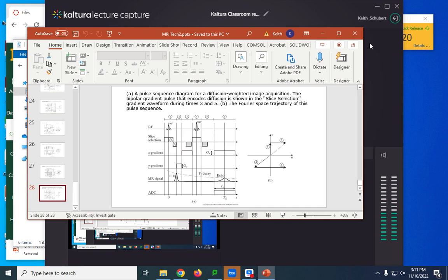And we can monitor your chest motion. Both your heartbeat and your breathing are readable on your chest. Your heartbeat makes about a 0.5 millimeter difference in your chest motion. It's really small, but those cameras can read down to about 1/10 of a millimeter, so it's good enough. So we can get breathing data where you're not touched. But if it's a long thin tube, a narrow bore to get a good image for a whole body scan or something of that sort, it's all gone again.